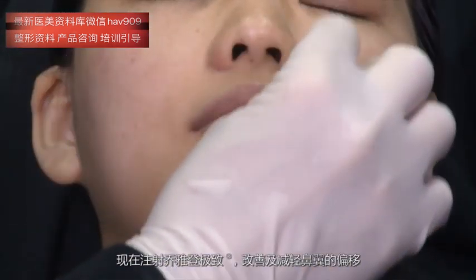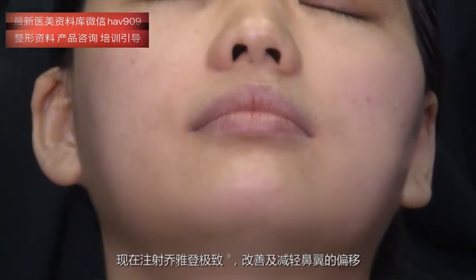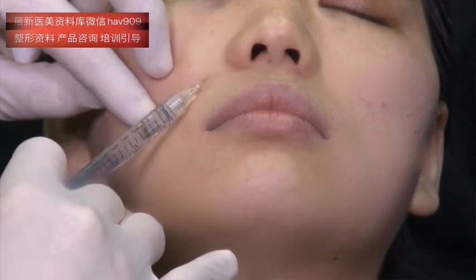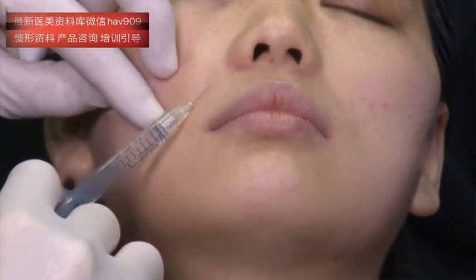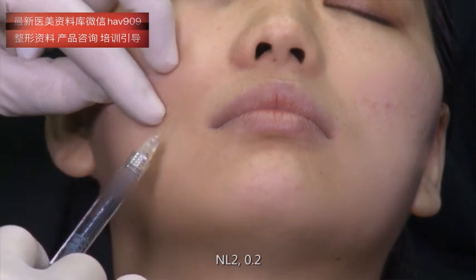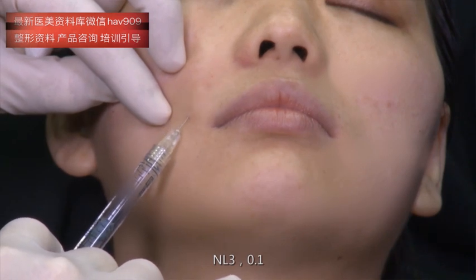Now injecting Ultra Plus to improve and also reduce the excursion of the nasal flare. Injecting NL1, 0.1, NL2, 0.2, NL3, 0.1.